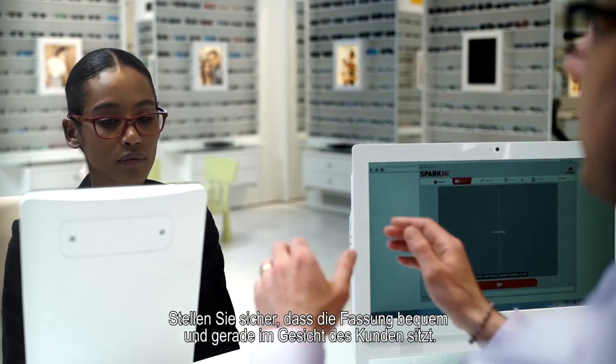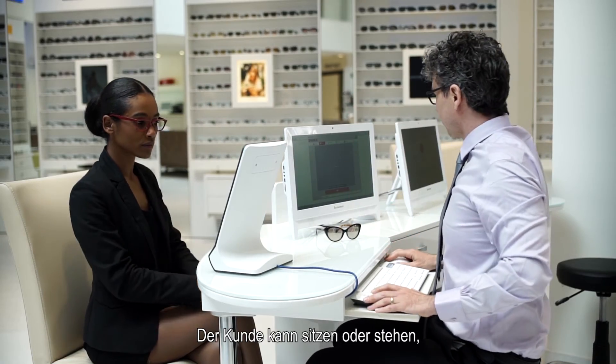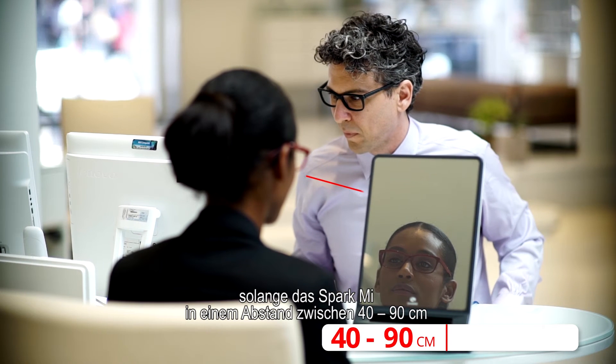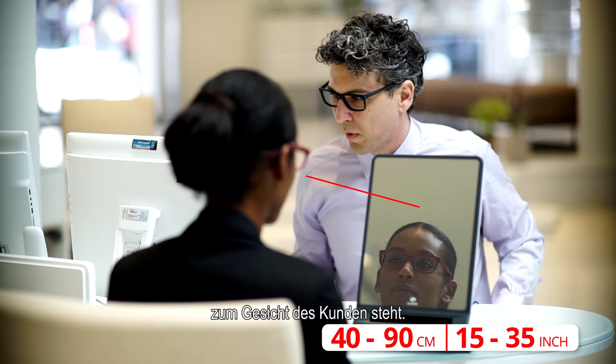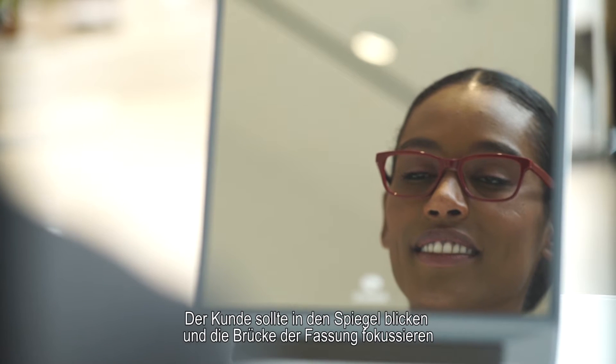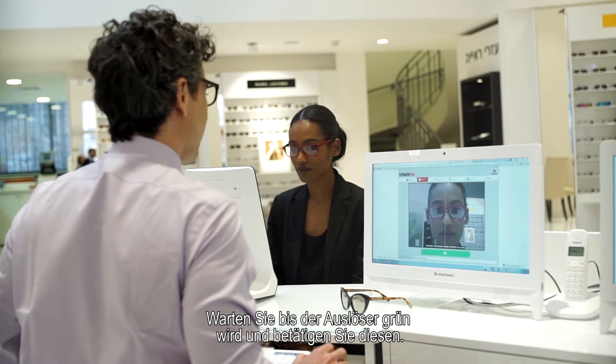Ensure that the frame is sitting comfortably and straight on the patient's face. The patient can either be sitting or standing, as long as the SparkMe device is 40 to 90 centimeters or 15 to 35 inches away from the patient's face. The patient should be looking into the mirror while focusing on the frame bridge. Make sure the picture on your screen is clear and in focus, then wait until the camera button turns green and click it.